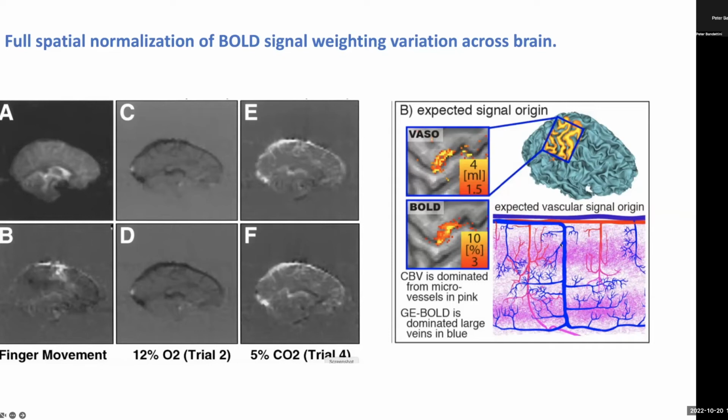So you really need to control for that when you go to this layer level activity. So that's a big issue. The problem is we can calibrate this based on a CO2 stimulus. It's just a matter of, we end up dividing two signals, which reduces our signal to noise. So there should be maybe more robust ways of doing this.